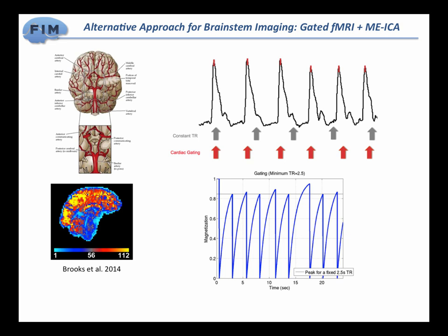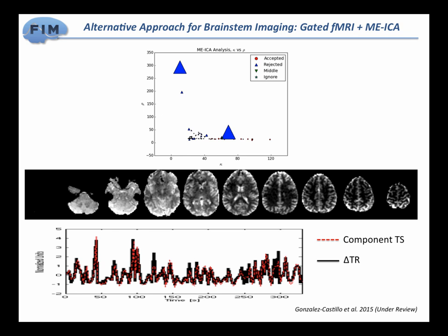But the other way to go around, if you have MEICA, is those signal fluctuations are of a T1 origin. They're on the S0 part of the signal, so they're not BOLD-like. So the theory says that MEICA should be very good at capturing these guys, mark them as bad, and then leaving them out of our data. And we tried that experimentally, and it works very, very well. We don't know if too well until the reviewers approve it, but we think it's good enough.